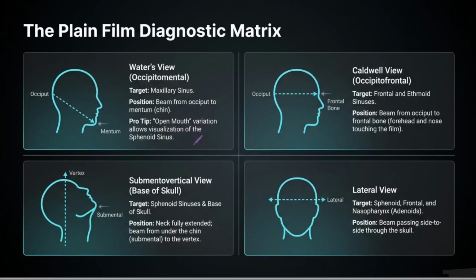The basal lamella is a bony partition that physically separates the anterior ethmoid cells from the posterior ethmoid cells. So when a surgeon is studying a CT scan, finding that partition tells them exactly how deep they are navigating into the facial structure. Exactly, it's their anchor point. They also have to locate highly specialized structures, like the Agger nasi cells. And those sit at the very front of the ethmoid honeycomb, right? Correct. And they also map out the nasolacrimal duct. Which is that dense bony tube that continuously drains tears from your eyes into your nasal cavity.